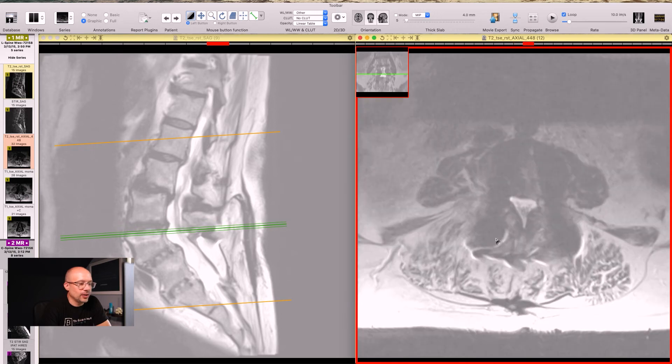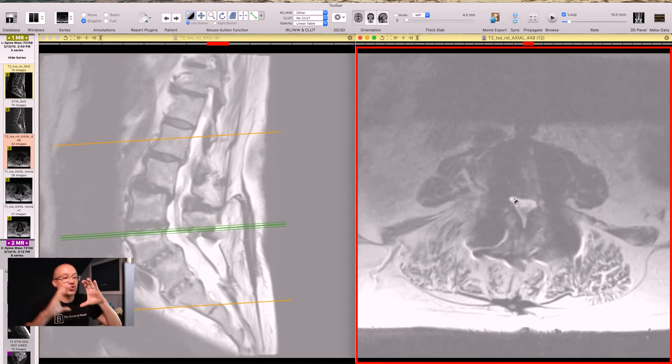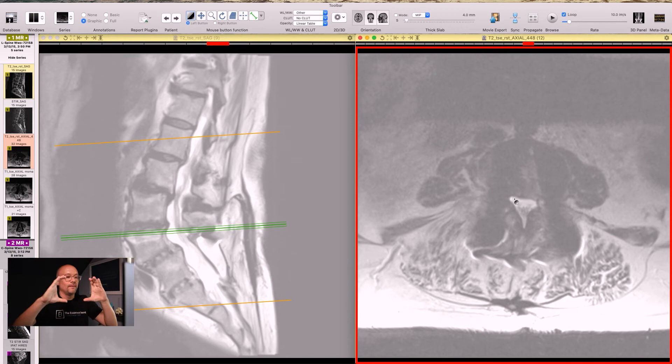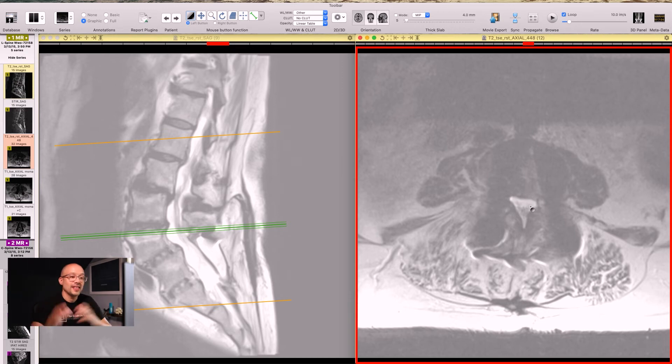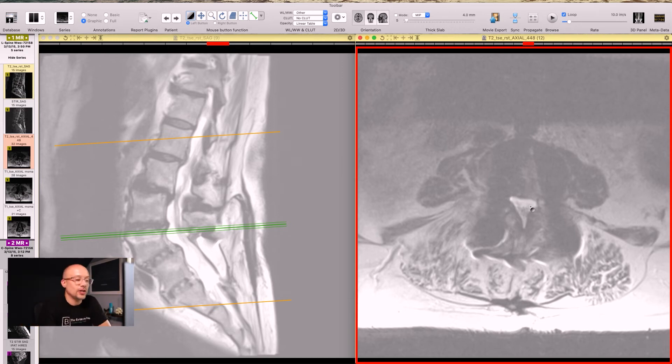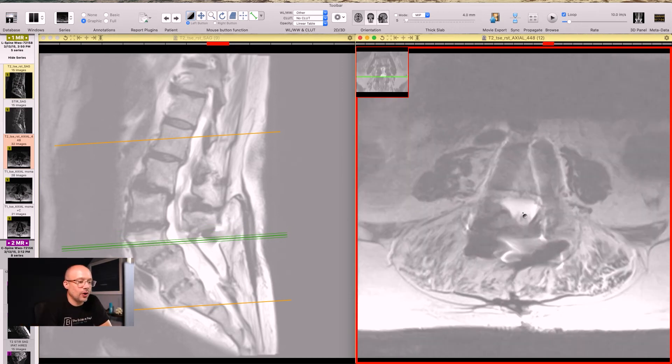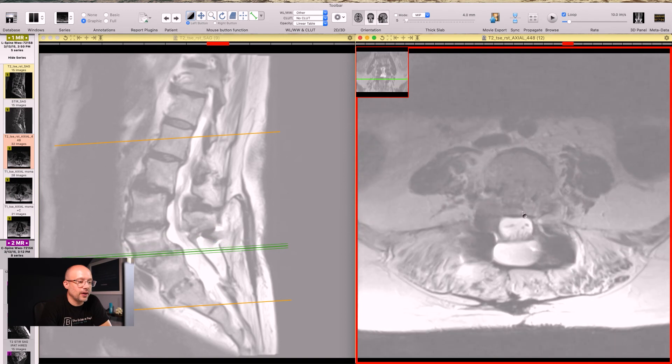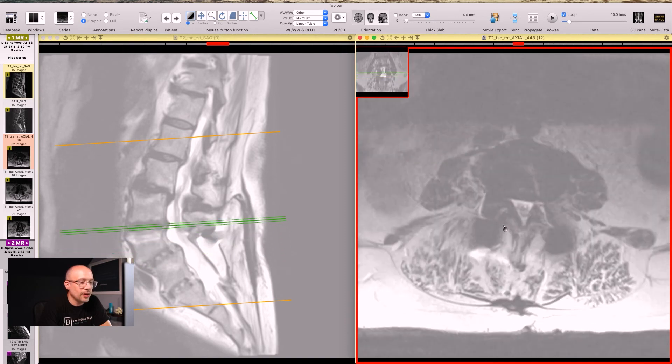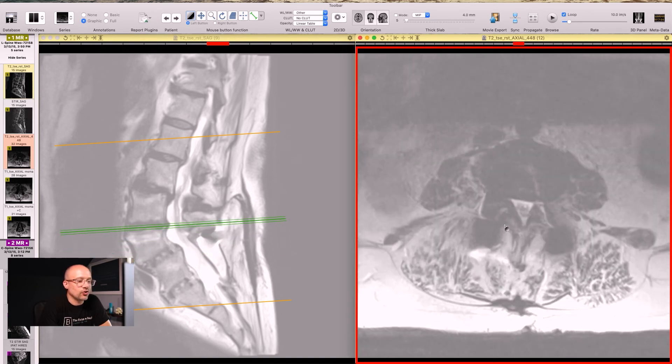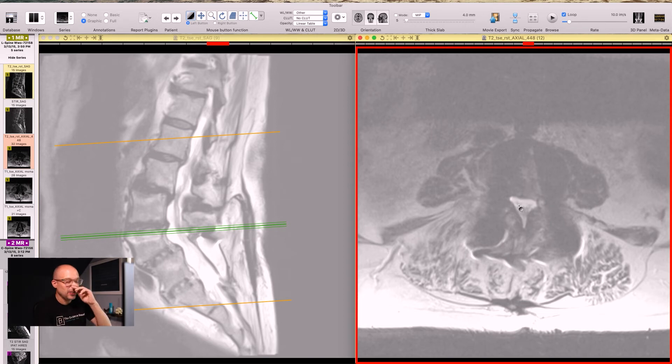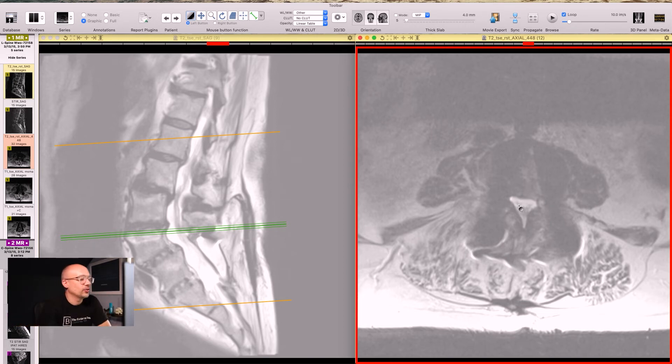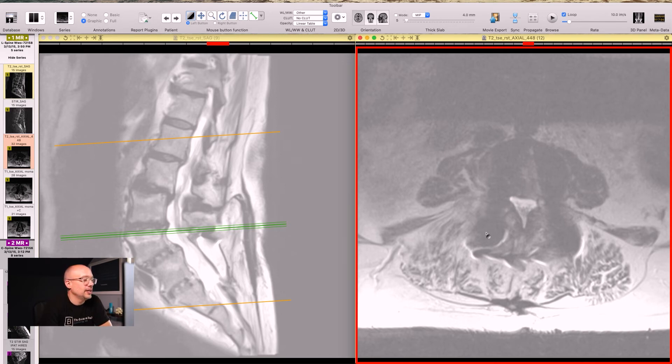Oh boy, now we start to see some challenges. That big, open circle that was the spinal canal now has become a very small triangle. Look at this white triangle on the right-hand side of the screen. That is stenotic. It's compressed. If we go down, watch it open up to be that huge, big circle down at the next level I'm circling right here. Or if we go up, you can see it crunches right down into a triangle. So there's definitely some stenosis or compression at L3, L4 right above the fusion in this individual.